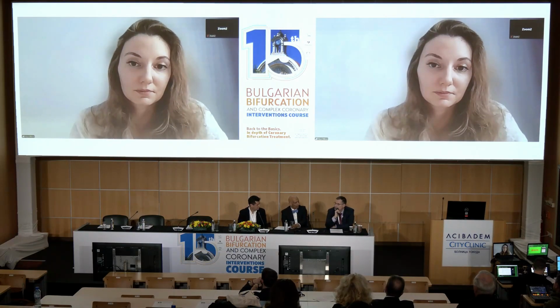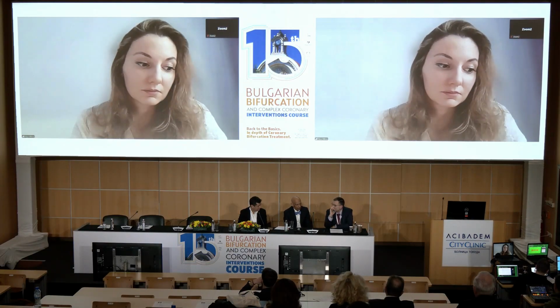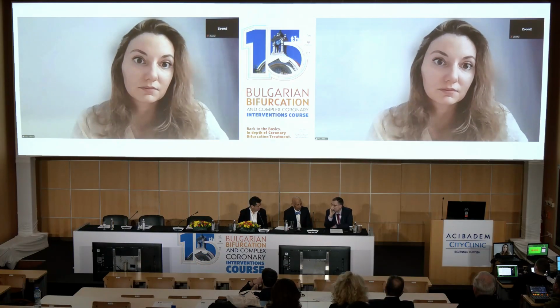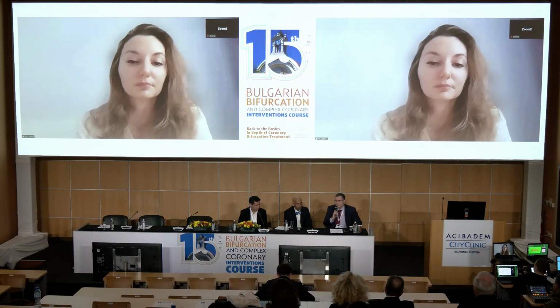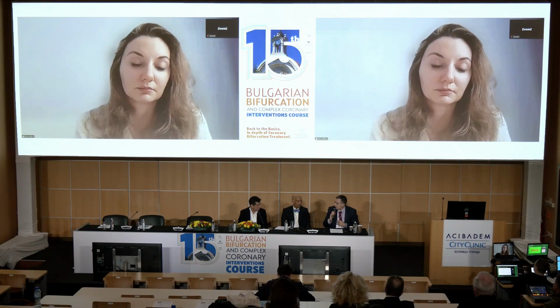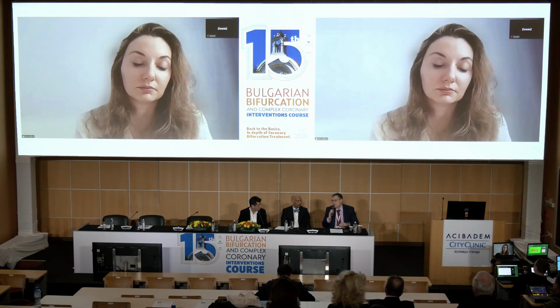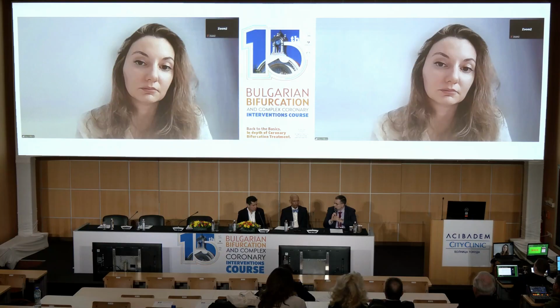Actually, sometimes it is easier to do a CT on the post-operative patient than angiography, definitely, with less contrast. But the protocol is different, just because it requires different synchronization with the injection and the acquisition phases. So it's a little bit different from the standard just for coronaries.